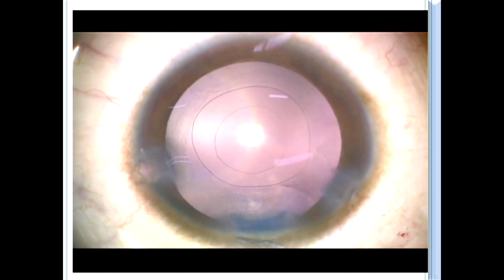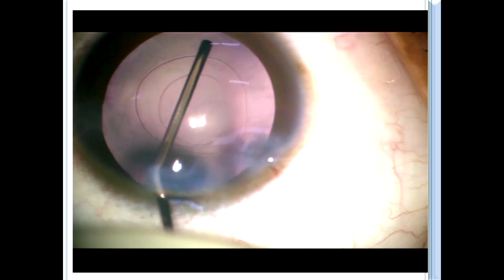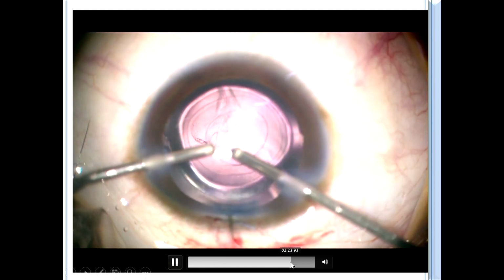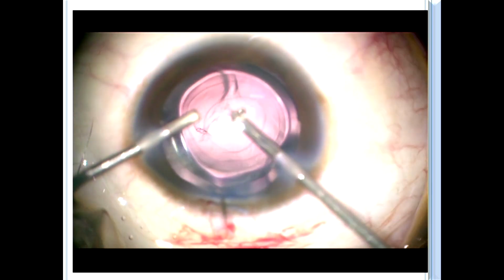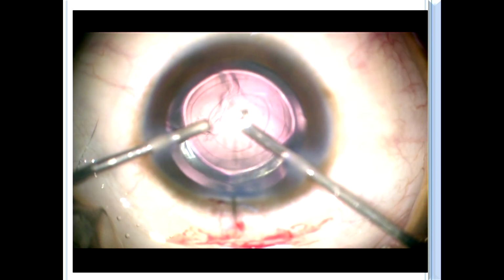A central anterior rhexis with a central posterior rhexis, and anterior vitrectomy is done. And then inject some high viscosity viscoelastic in the bag, and then inject the IOL in its position. So once the IOL is there in the bag, you remove the viscoelastic. You can use a vitrector to remove the viscoelastic by keeping it at IA cut mode when you are above the IOL.